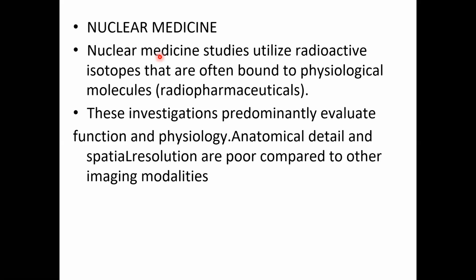Nuclear medicine. Nuclear medicine studies utilize radioactive isotopes that are often bound to physiological molecules. These investigations predominantly evaluate the function and physiology; anatomical detail and spatial resolution are poor compared to other imaging modalities. Especially, this nuclear medicine is the latest technology where we are using radioactive isotopes, and they are bound to physiological molecules.